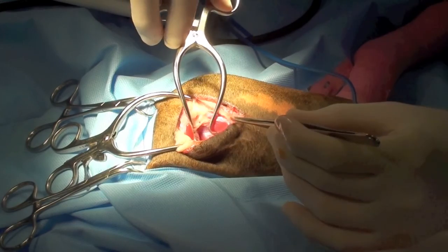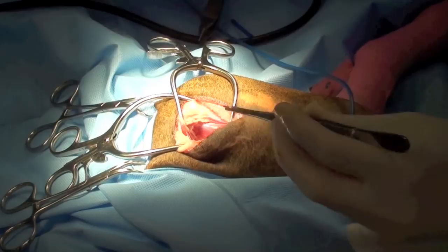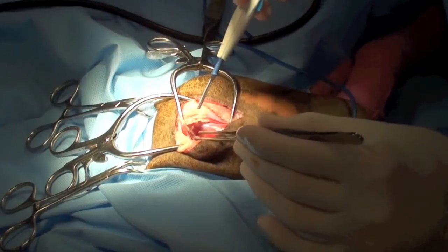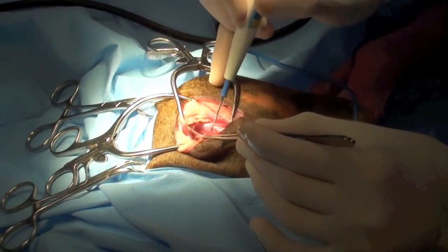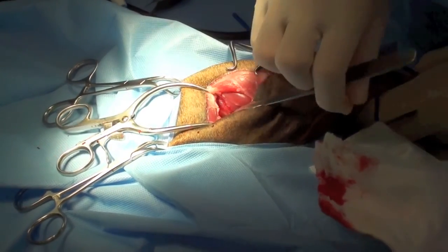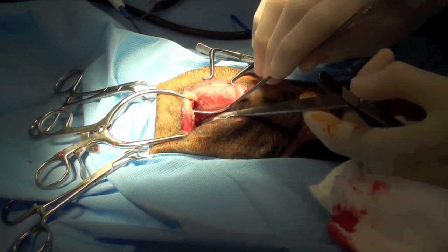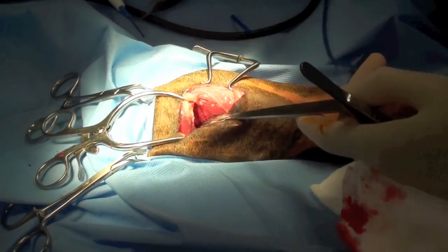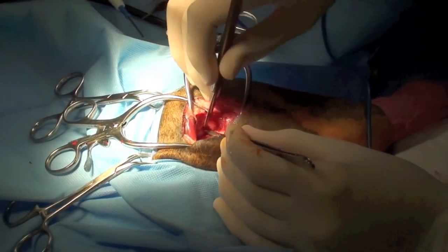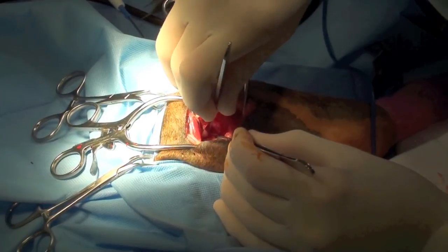A Gelby retractor is used to separate the middle gluteal muscle from the vastus lateralis. A Hohmann retractor is used to isolate the neck of the femur. A scalpel blade is used to sharply incise the joint capsule.